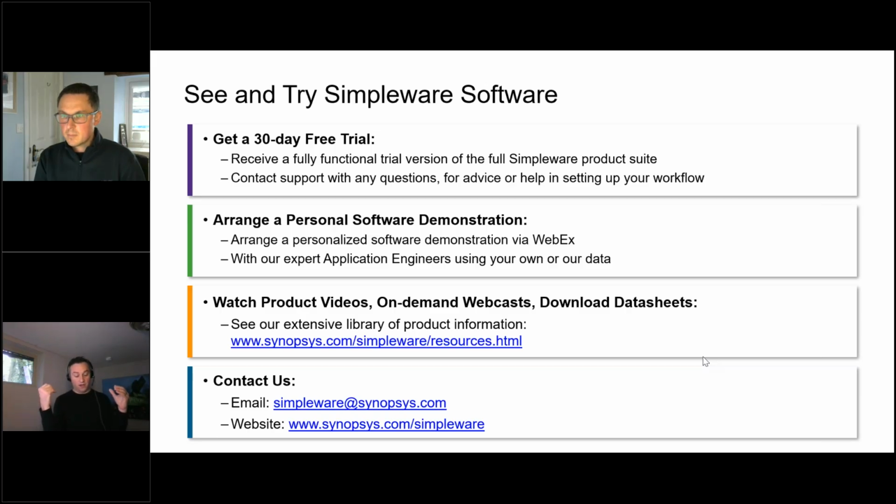But if you have really thick slice thicknesses and you can't get things in the manual workflow, then you can't scale that up. You have to be able to define a workflow initially, and then you can scale it. You can't generate extra data, or expect AI to do it if the person can't do it.